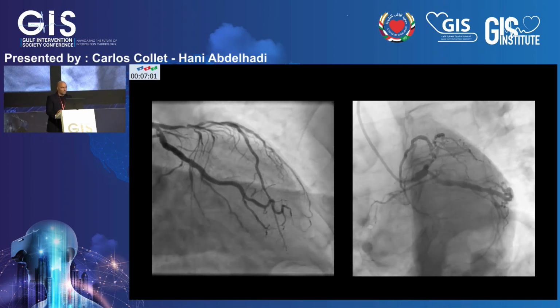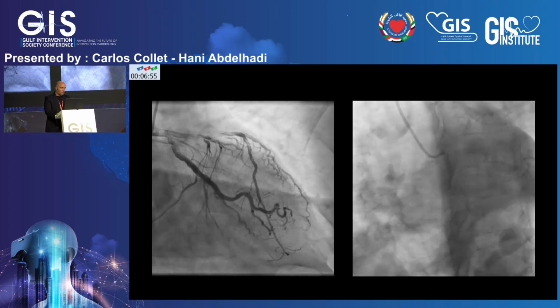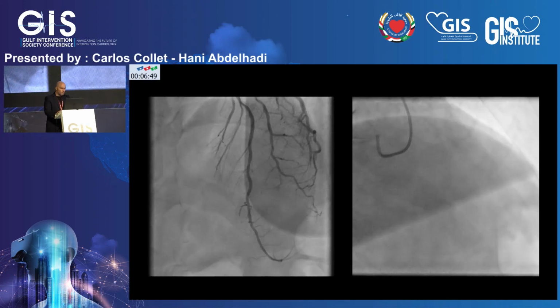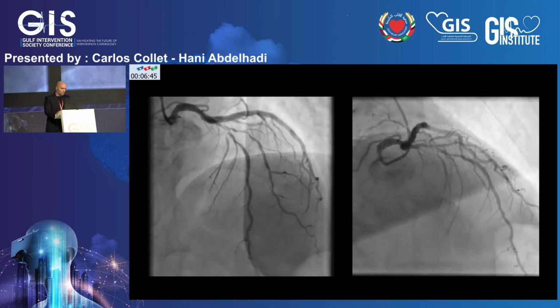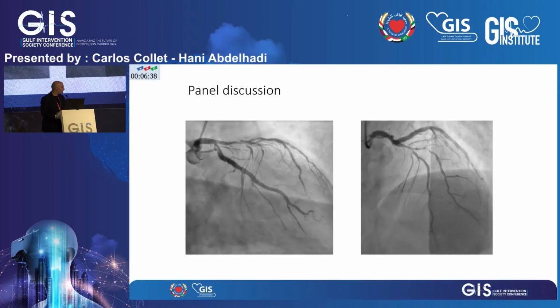I'll let this run for a couple of loops for everyone to just get an idea. I'm not going to comment on it just yet. So these are the caudal views, and here are the cranial views. I'm just going to pause and ask our panelists to give their opinion on this angiogram.